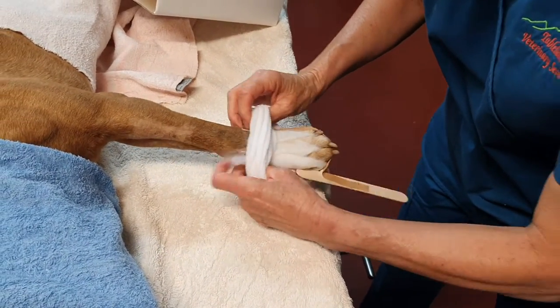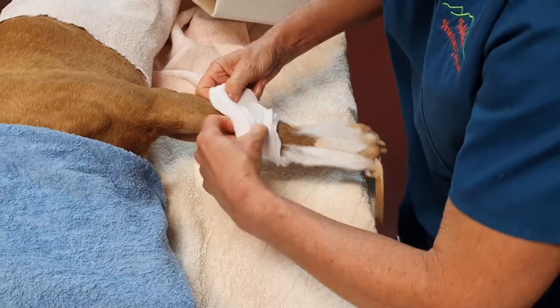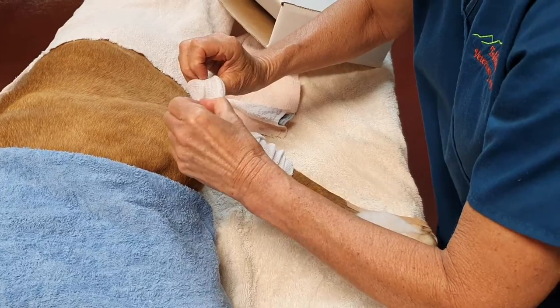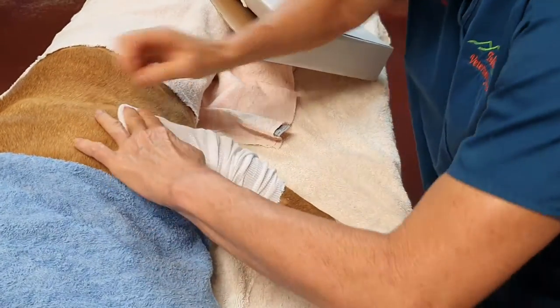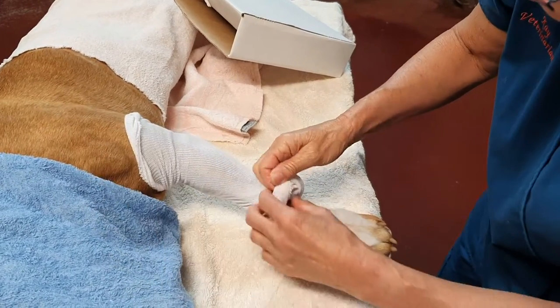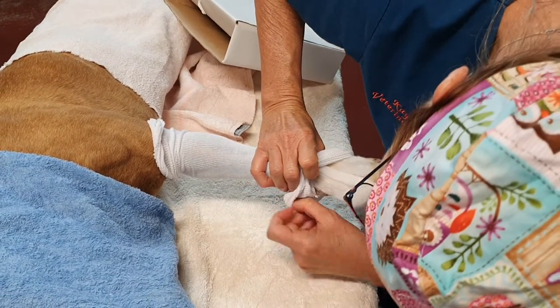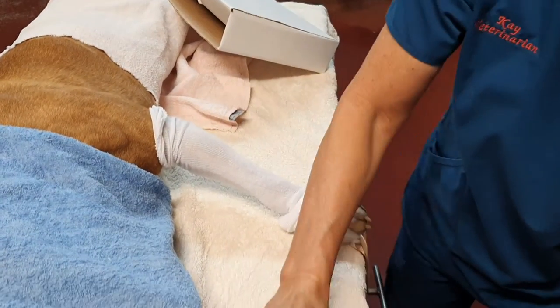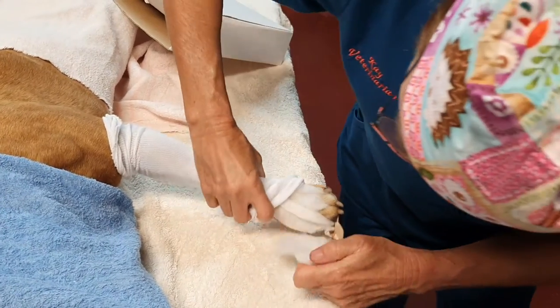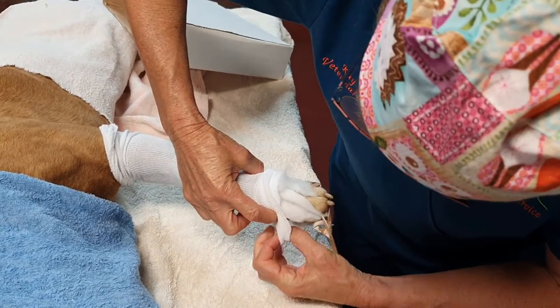Roll that up all the way to the top. If the toe spacers fall out, I just have to put them back in again. Take that all the way to the top, then open it up, working it up nice and high for starters, and then pull it down — that makes all the hair come in the same direction for extra comfort. Try and lift it over these toe soft band spaces. I lost the one underneath the dewclaw so we'll just put another one back in there. Just keeps the dewclaw up and off the underneath leg.